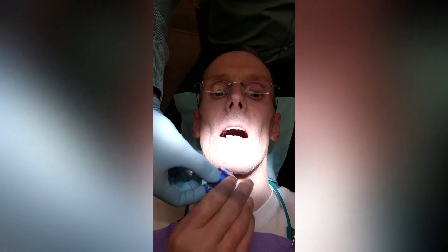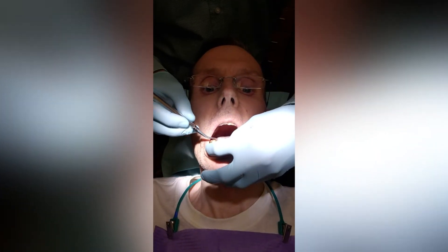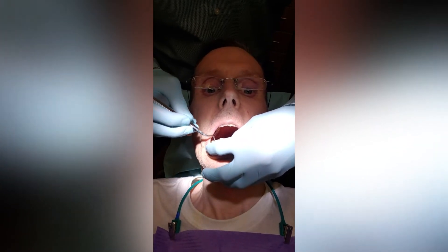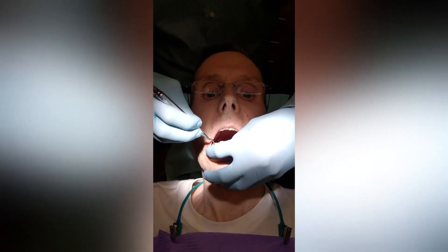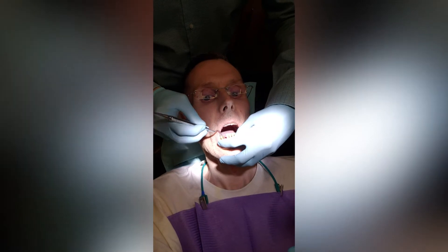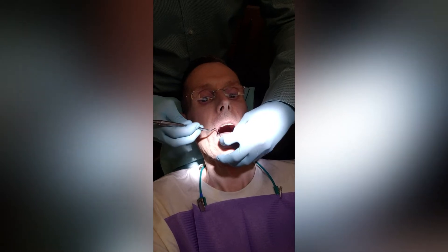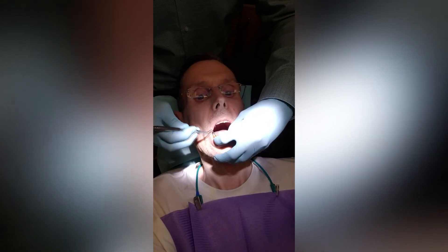We're going to let this fill up with blood a little bit more, and I'm going to scoop away any infected tissue that might be around the tooth. You might feel me scraping a little bit — stop me if it's tender. No more suctioning here so we can see blood kind of filling up in that socket.